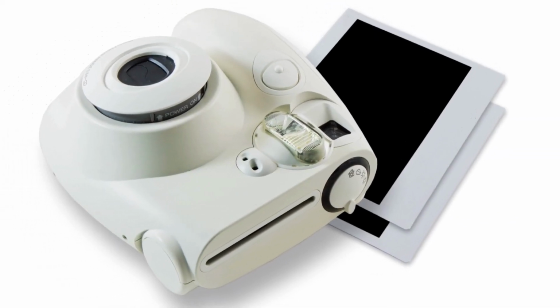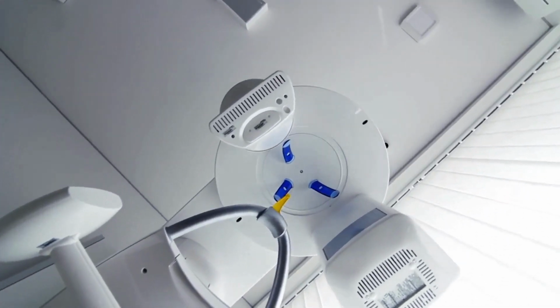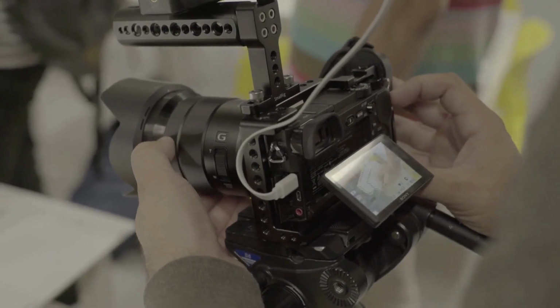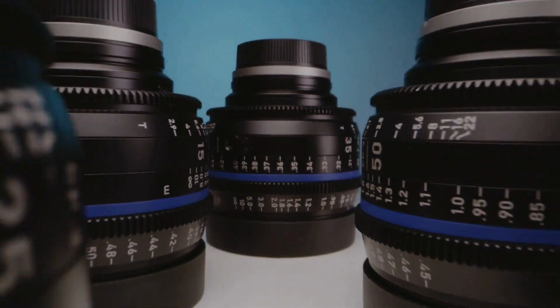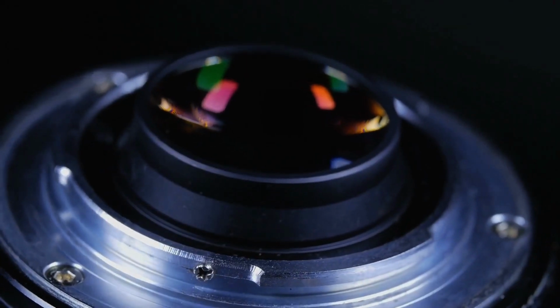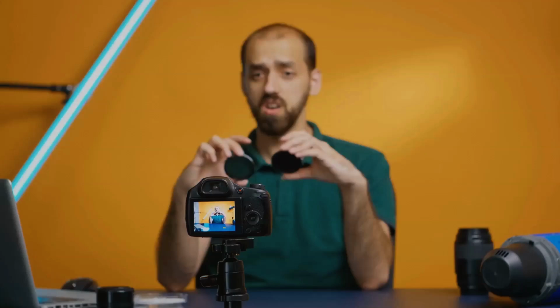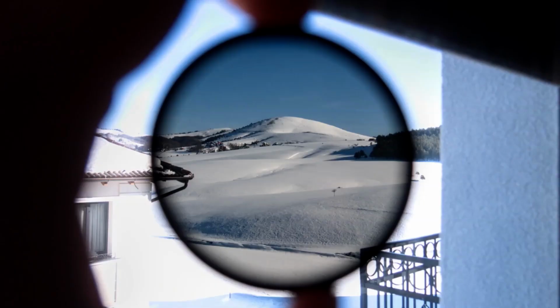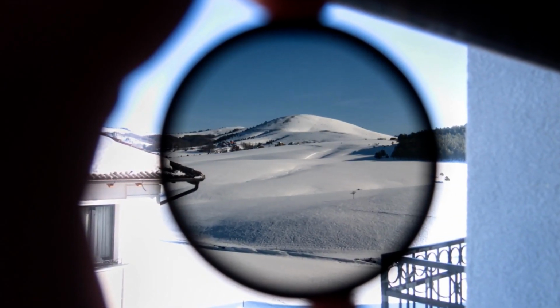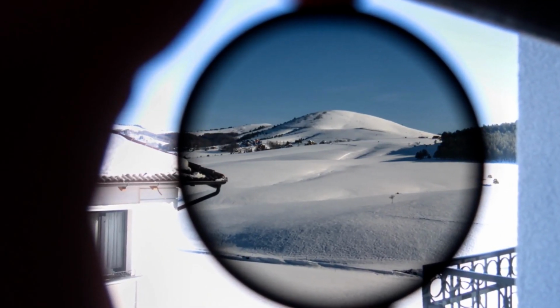The camera should be capable of capturing high-resolution images and should have a lens that can accommodate a polarizing filter. DSLR cameras are commonly used for their versatility and image quality. The heart of the system lies in the polarizing filters. These filters are typically circular polarizers, designed to be mounted on the camera lens and the light source. Circular polarizers are preferred over linear polarizers in photography, as they do not interfere with the camera's autofocus system. It's crucial to choose high-quality polarizing filters that effectively block unwanted reflections without introducing any color cast or distortion.